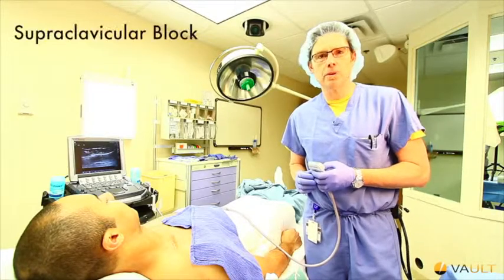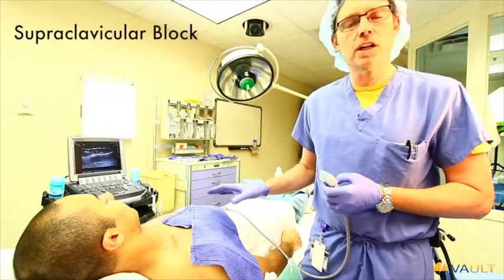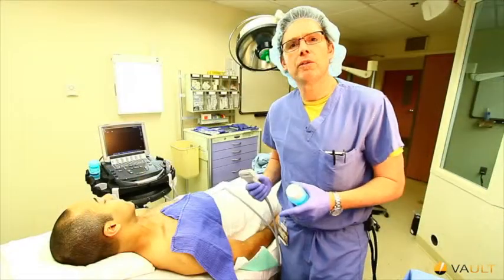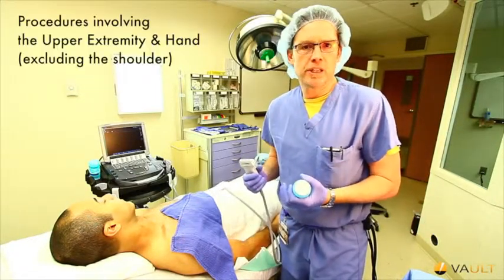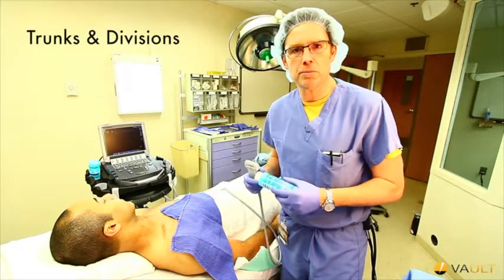I'd like to start with the supraclavicular block because I think it's a good basic block in that it offers contrast on the ultrasound image and some easily identifiable images. The supraclavicular block is a good option when performing surgical procedures in the upper extremity and hand, excluding the shoulder. We're going to target the trunks and divisions in this block.